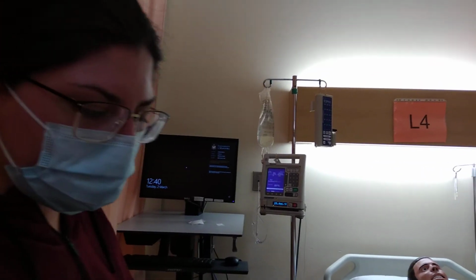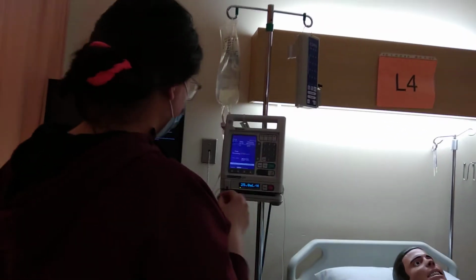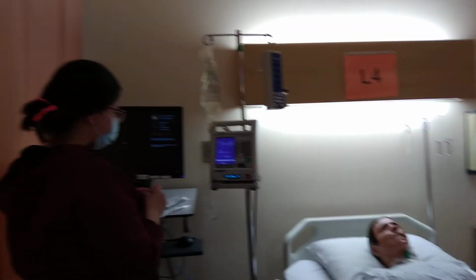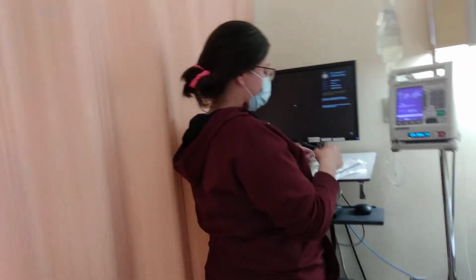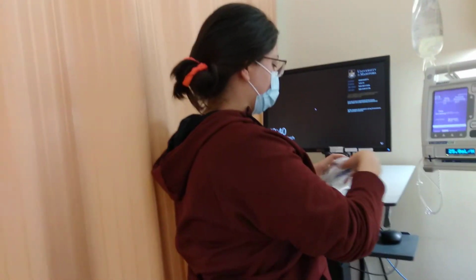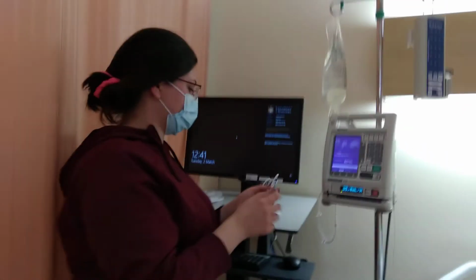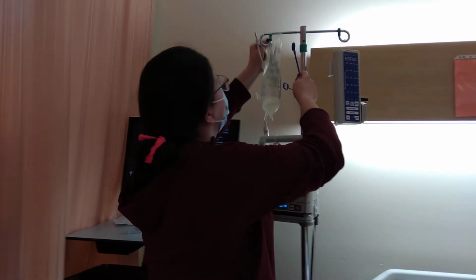Okay, so now I'm going to, what time is it? 11 minutes. I'm going to connect my system here. Right now I can go ahead and do my, going to first place this down.